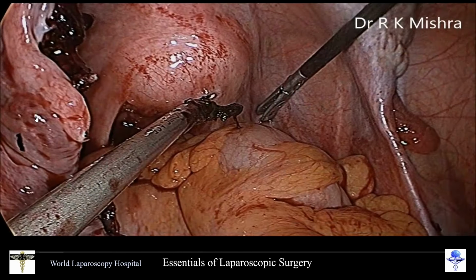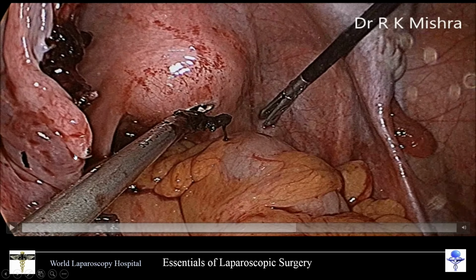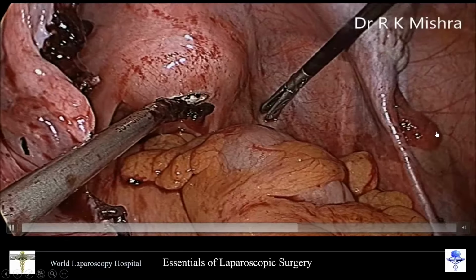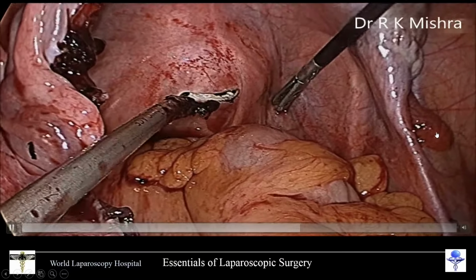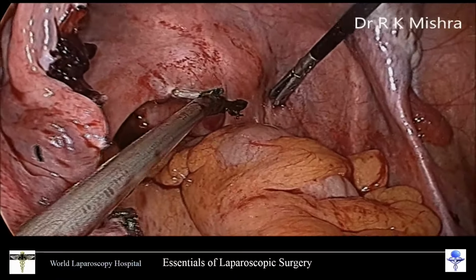This is the usual port position, and here is the colpotomy. This is the tube. The tube is okay. This is the ovarian ligament. This is the other side of the ovary. This is the other side of the tube. This is a nulliparous woman, so that's why you have less space here. But in spite of that, it can be managed.